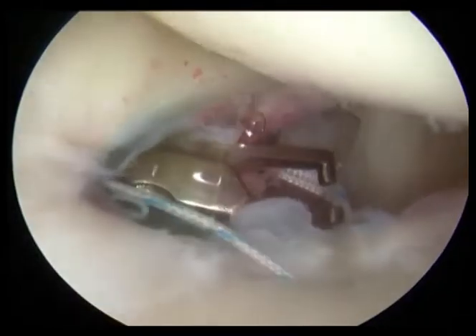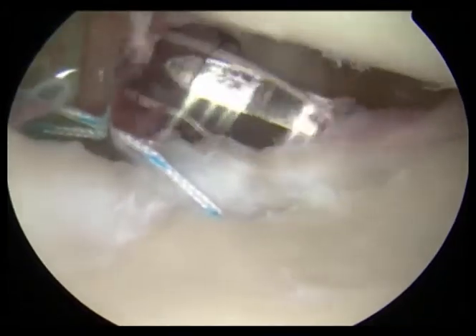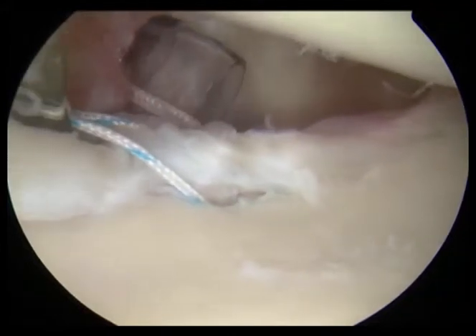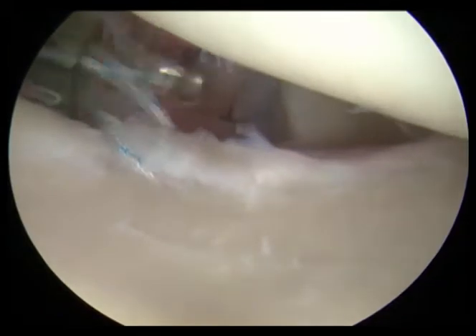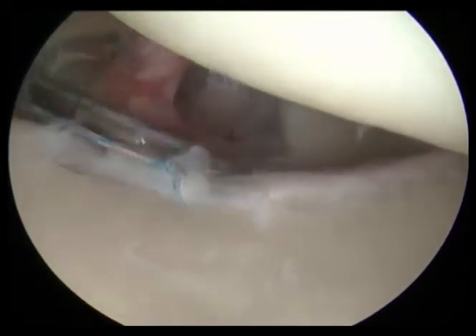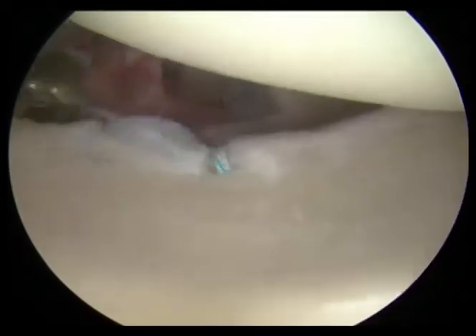Here we're finishing this final suture, tying the knots up at the one o'clock position on the clock face. You can see the labrum coming up against the bone really nice and snug — that gives the suction effect we're after and the stability in the shoulder that we need. Here we are tying our final knot, and you can already see the labrum from left to right lying up against the bony glenoid.